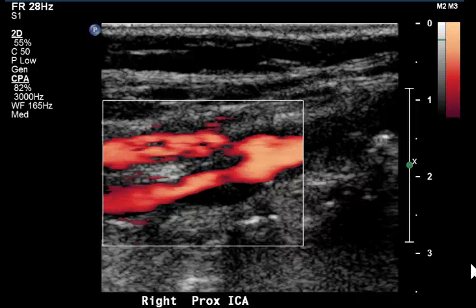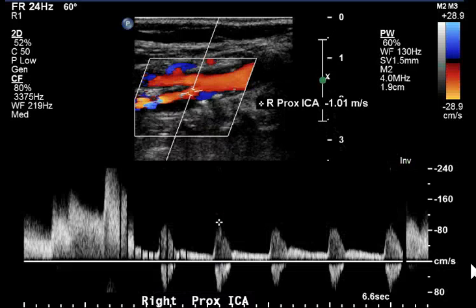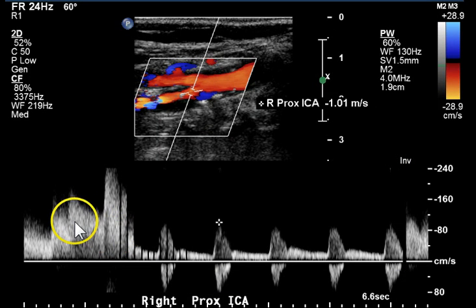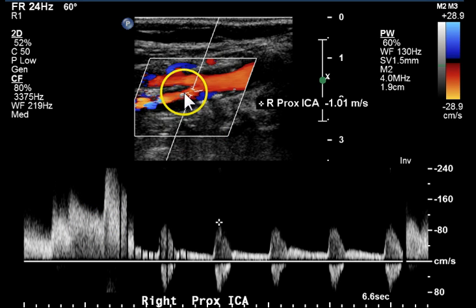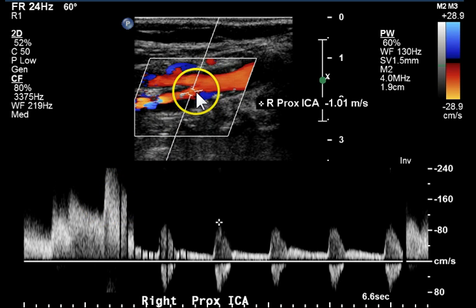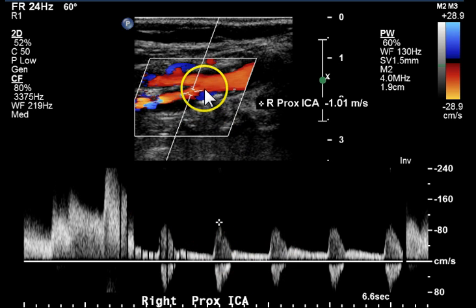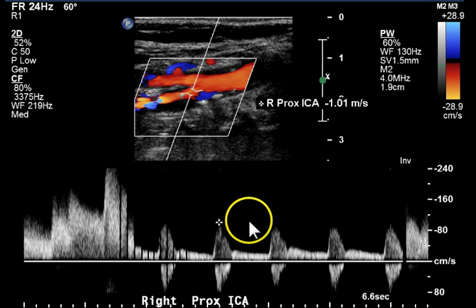Power Doppler again demonstrates a narrowed flow lumen in the proximal internal carotid artery. This Doppler signal shows the gate walked from the level of stenosis to an area where there's flow reversal, and we see bidirectional flow. The gate was probably straddling the flow reversal to get this type of image.